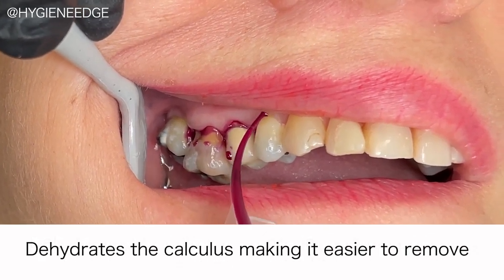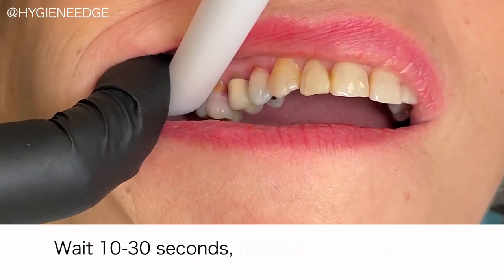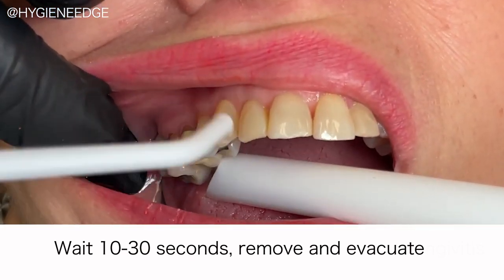Here we're using it pre-scaling to dehydrate the calculus, making it easier to remove. It's nice that it comes out colored, so you can easily see where you've placed it, and it differentiates it from the blood.